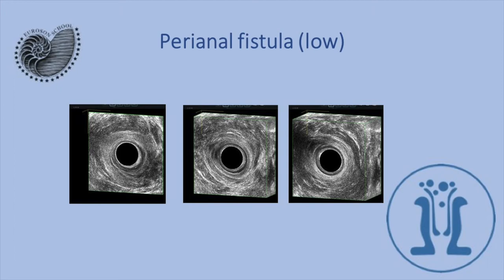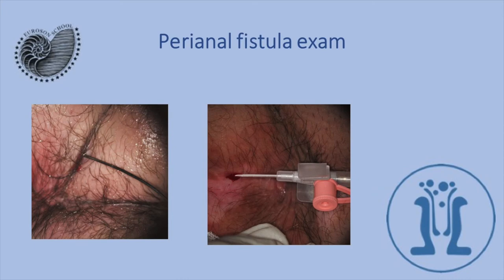Here we see an anal fistula in the internal anterior position with hydrogen peroxide inside the fistula. Most often we should examine the patient with a probe and hydrogen peroxide injection into the fistula tract.